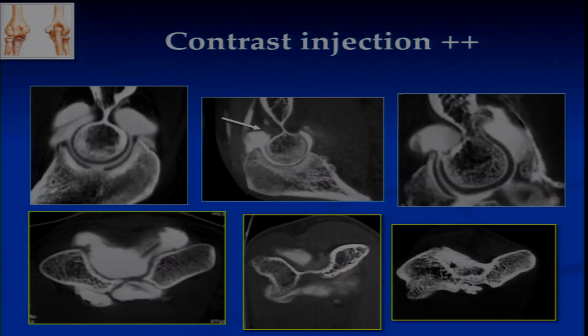Just to explain some cases, here is an arthro CT scan with injection. Here is a normal CT scan. That means you have between the coronoid fossa and the olecranon fossa a thin bone block with some synovium on each part. On the horizontal plane, that's what it looks like. After a dislocation, you see here there was a coronoid fracture which has been removed. You have the same thin bone, but a fibrous filling of the fossae, which is much more important.